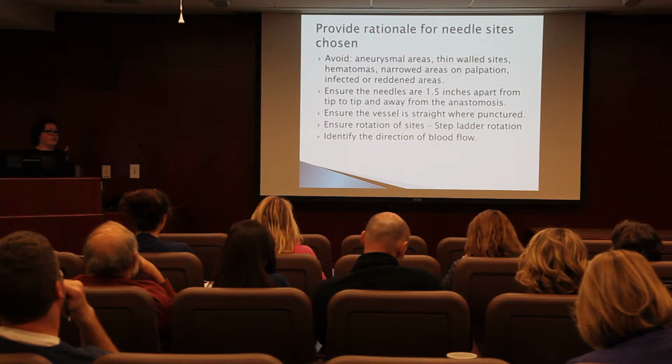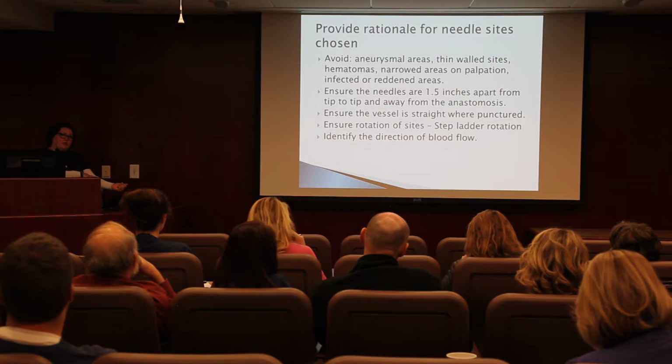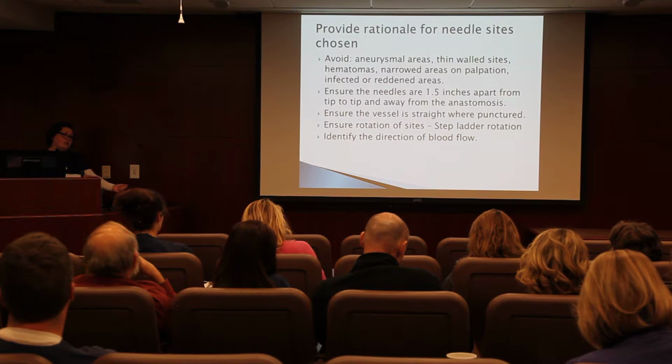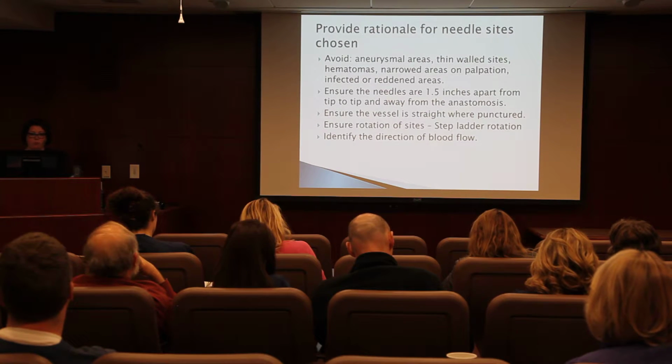You want to ensure the needles are 1.5 inches, or we say 2 finger widths apart, between each other and from the anastomosis. You don't want to put a needle into the anastomosis. Keep it 2 finger widths away. Ensure that the vessel is straight.